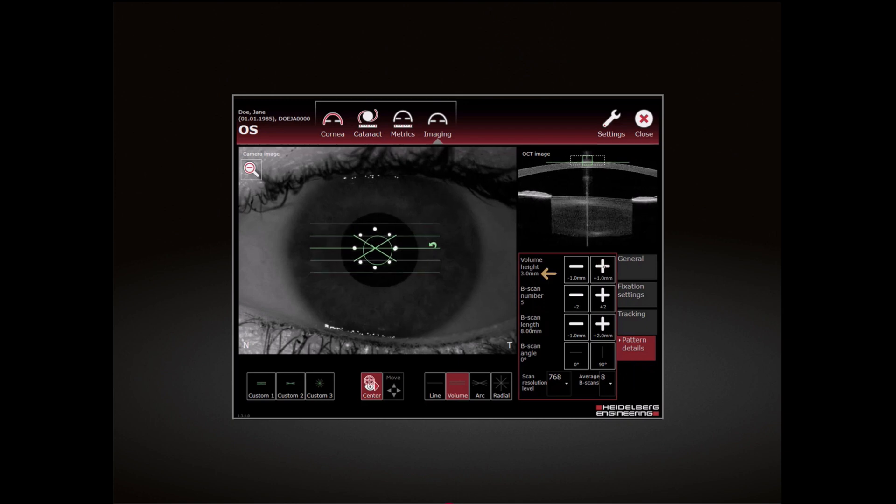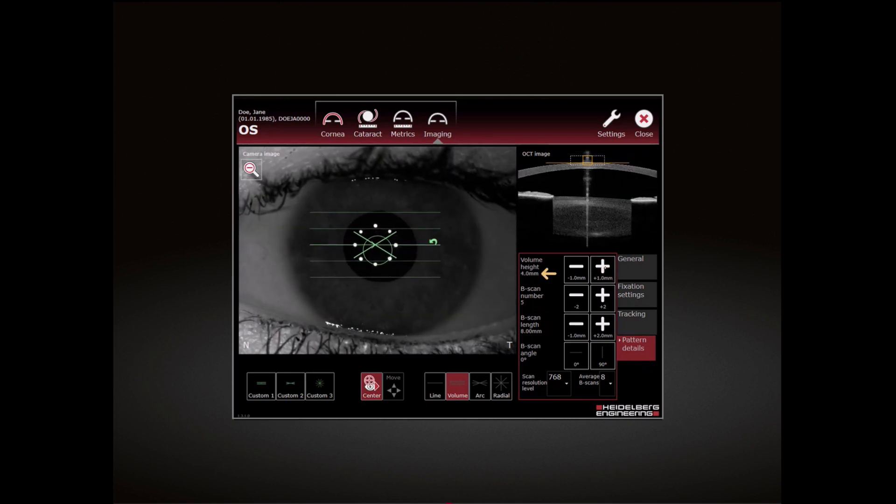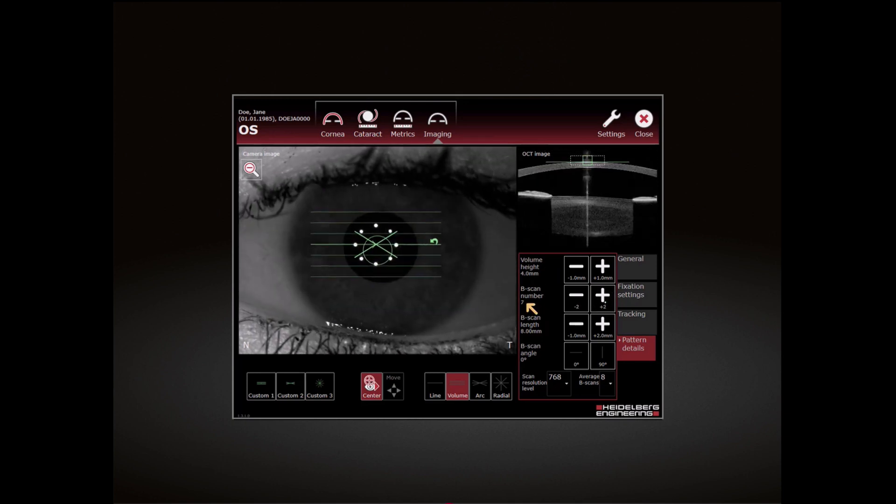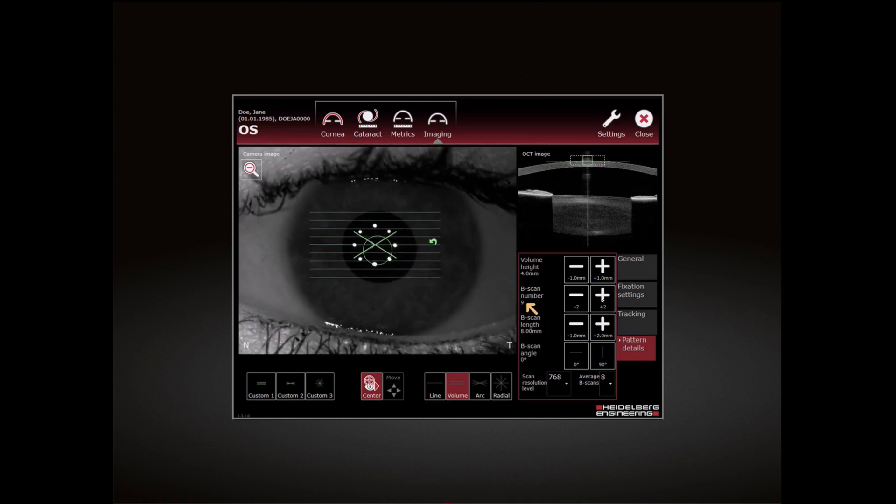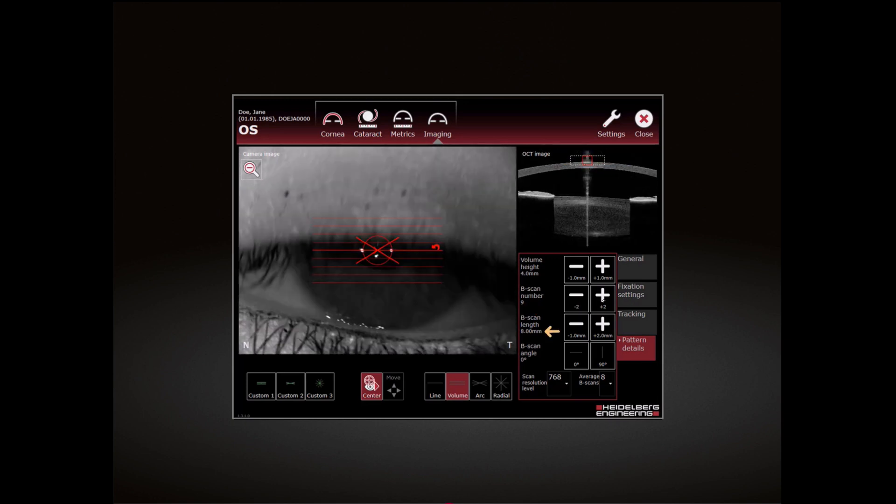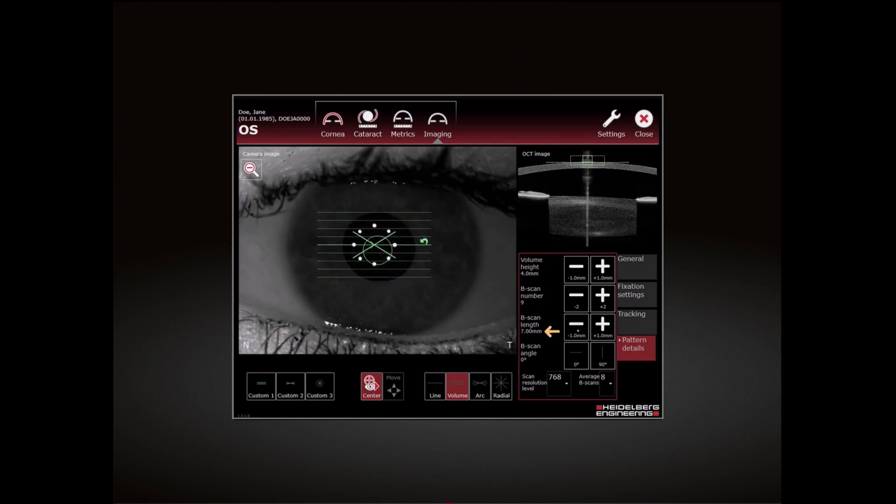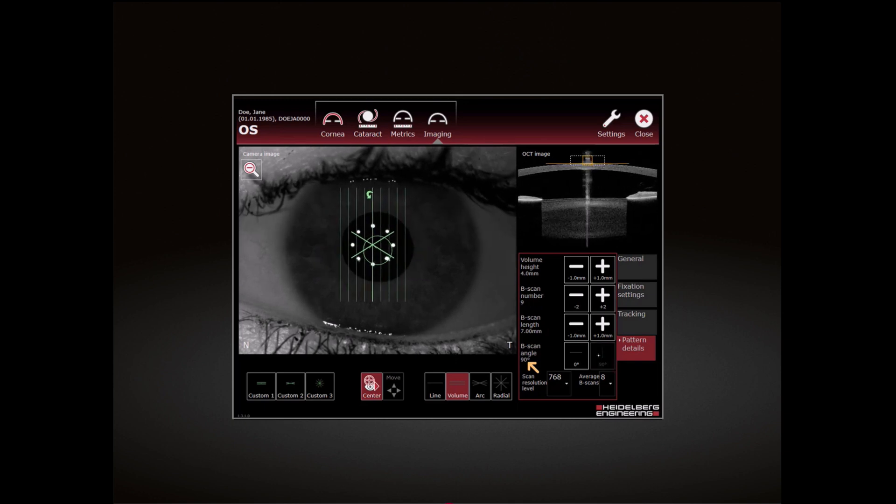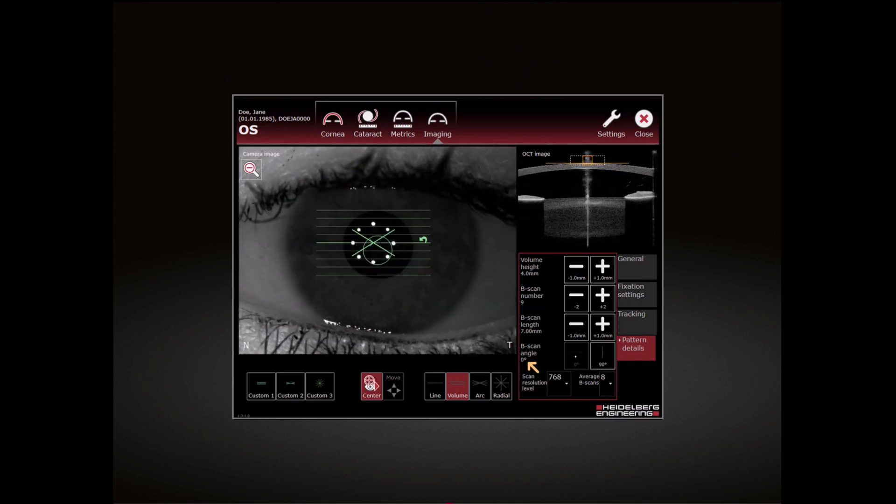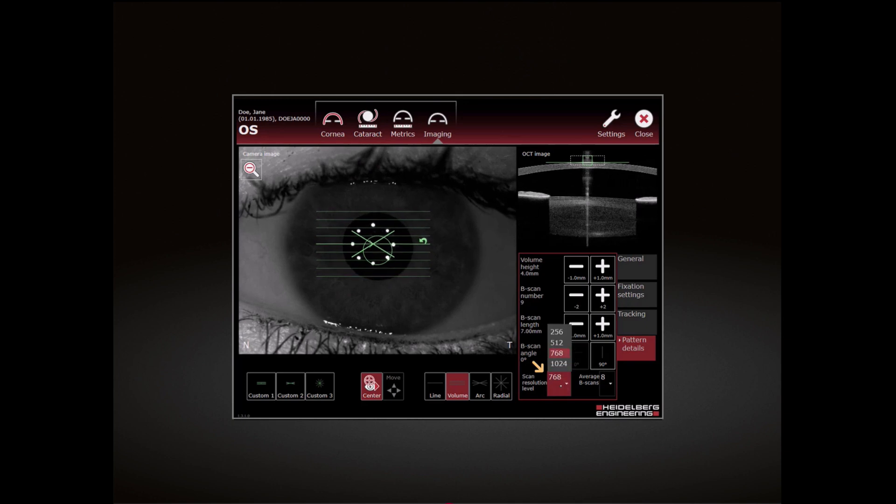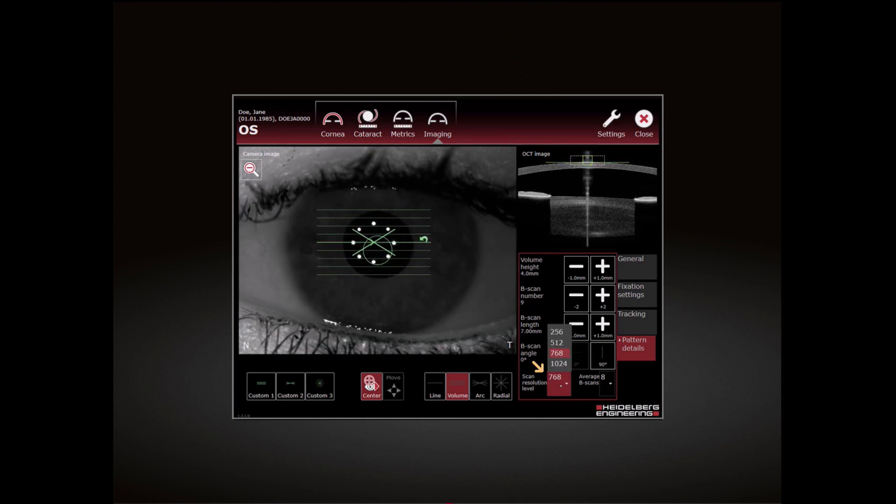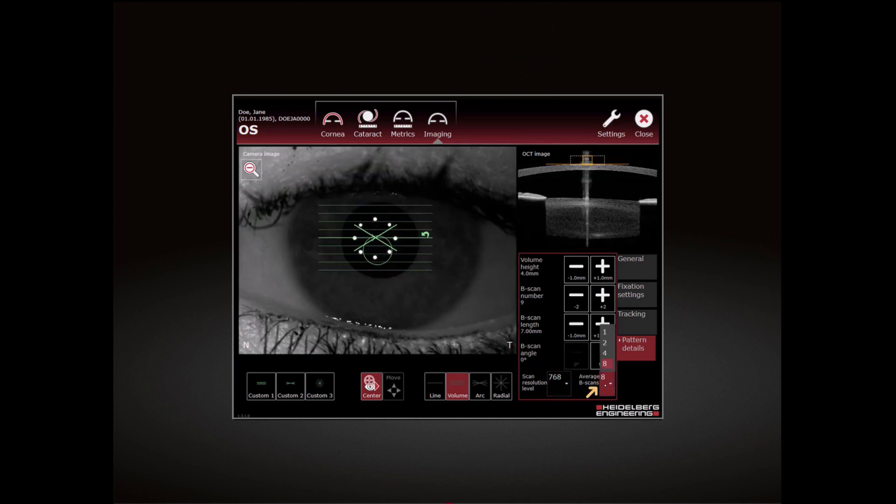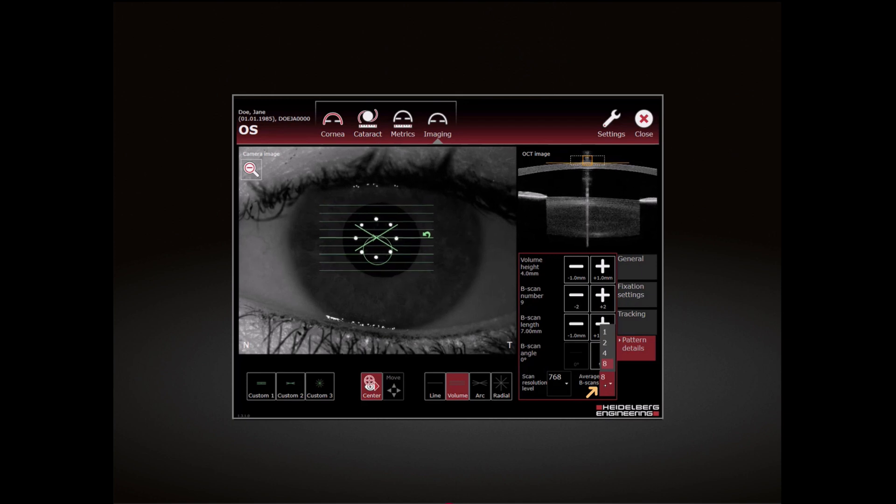Change Height of the Scan, Number of Scans, Length of the Scan, Angle of the Scan, Resolution Level, and Number of B Scans Averaged.